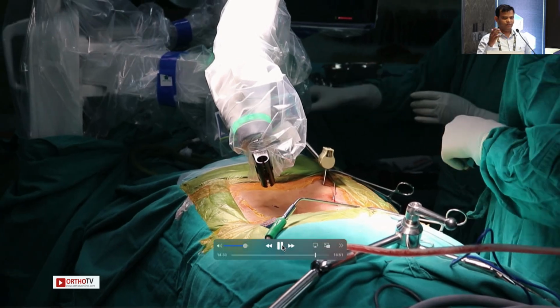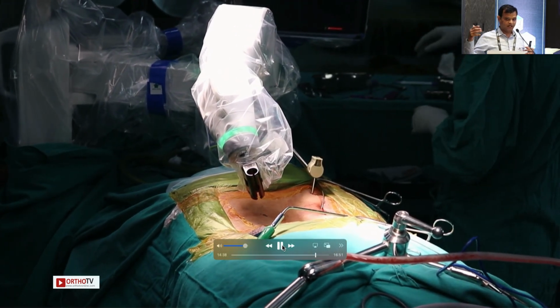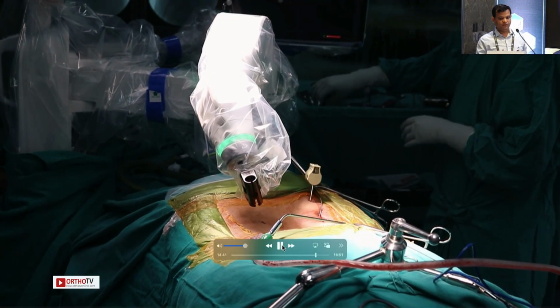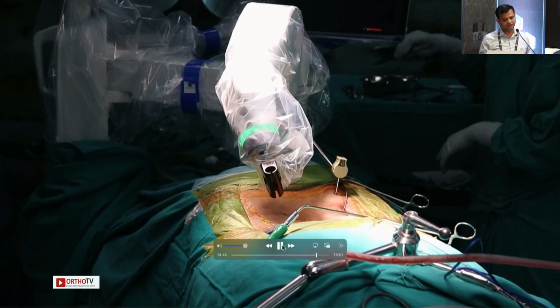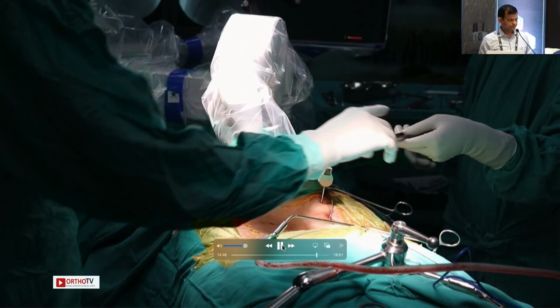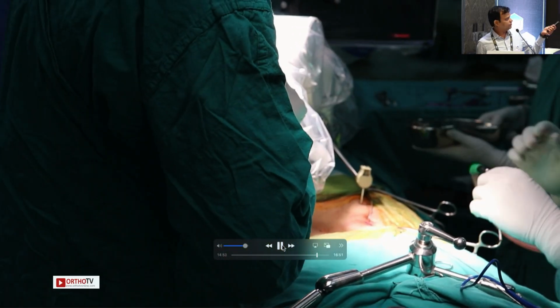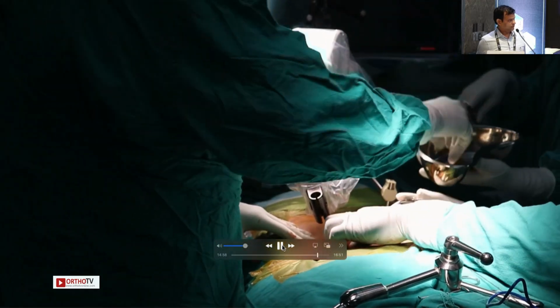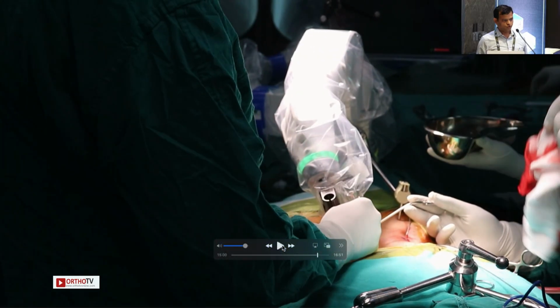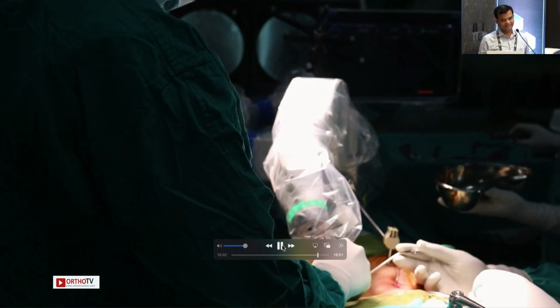And ultimately the navigation is all about the relationship between your screw and the screwdriver, and the length, the depth, the diameter, everything matters. So you can copy and make a screw holder for that, and then you can navigate your screws. You can do that here. I think in Singapore we can't. So that's the knife you can see, which is the robotic guided one. That's a long knife. You have two kinds of tools, short tools and long tools. You always try to use short tools because that decreases your skiving potential.